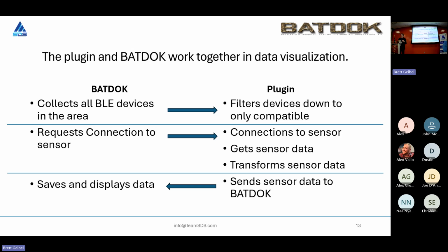One of the things I really like about BATDOK is its ability to incorporate live data in a high intensity environment, as we know a lot of these medical providers are in. Some of the advantages are that they might have BATDOK on a little phone on their arm, as you saw in one of the pictures. They could be working with 3 patients, 4 patients, or even more, and they could be working on patient number 3, and their BATDOK application, because of the sensors, starts beeping at them, saying, hey, patient 1's heart rate has dropped to this level, and they can move over to patient 1 and start providing life-saving care.